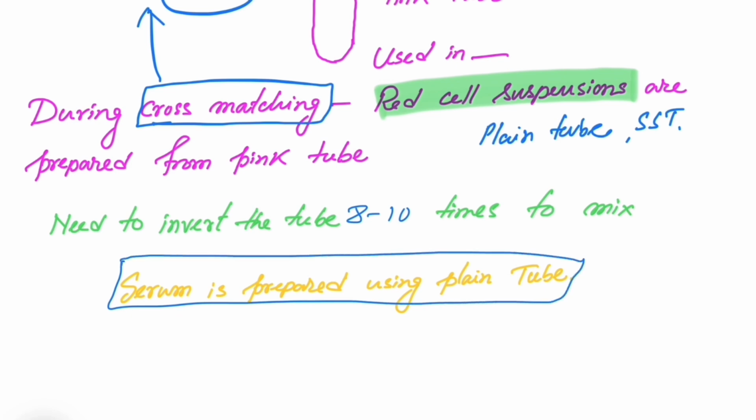And I told you that the serum is prepared using the plain tube.